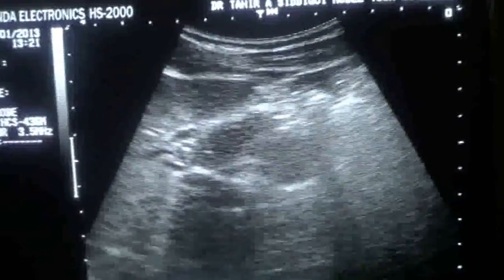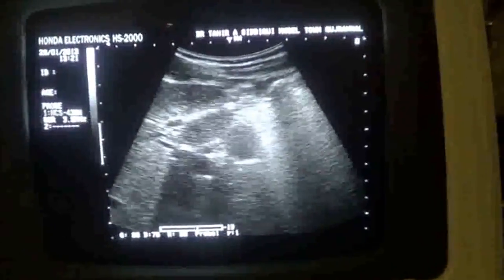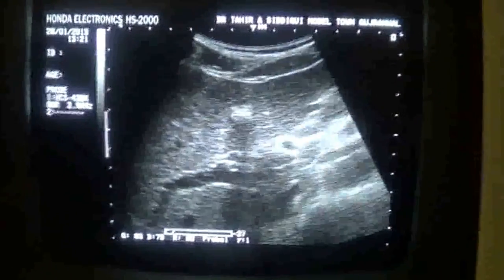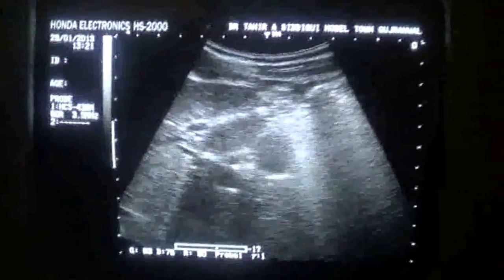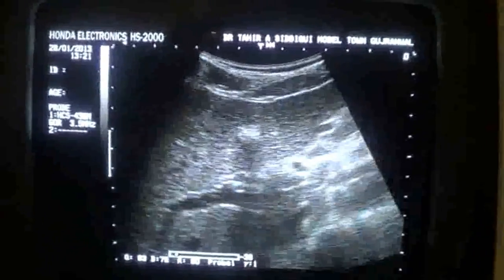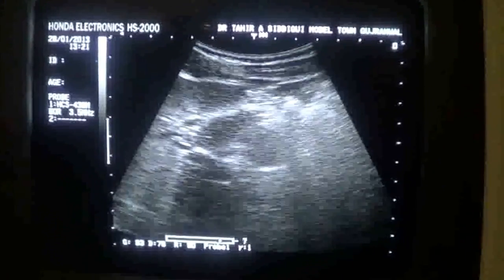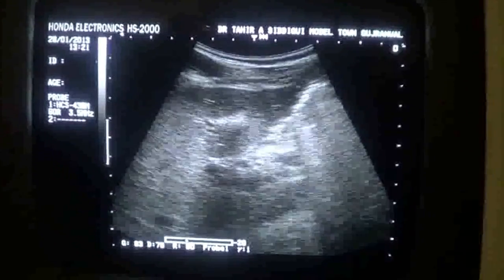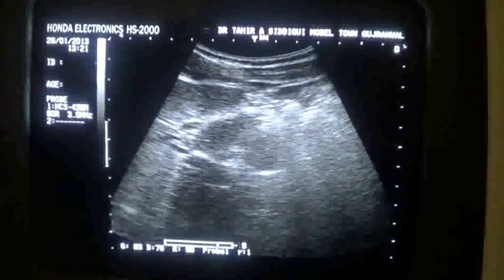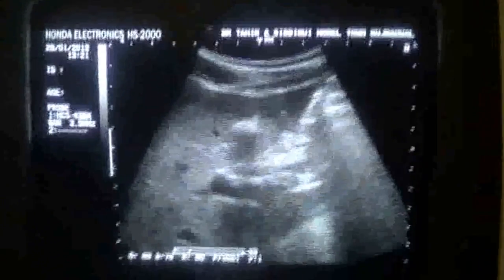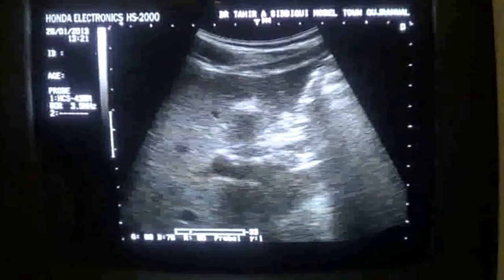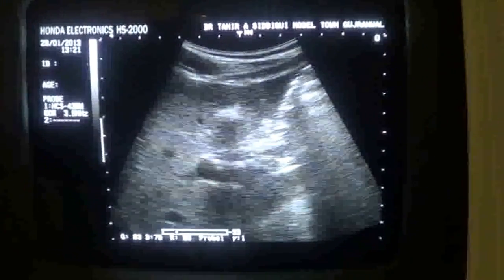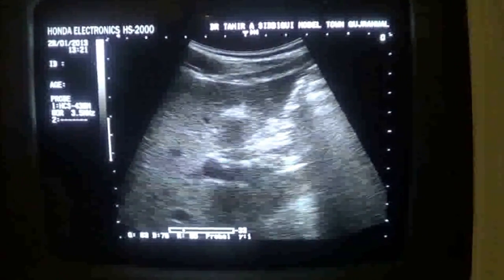This is how we differentiate such lesions on ultrasound. This is very important in sonology, because if one is not aware of these things, one can make a mistake while reporting. So always rotate the probe whenever you see such a lesion within any organ or any region. This is the ligamentum teres in transverse section. Thank you.